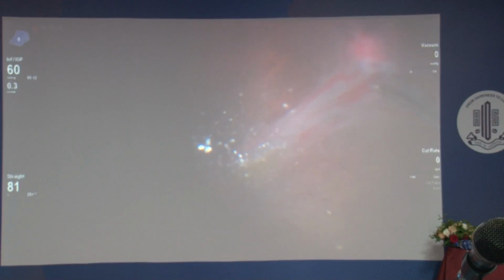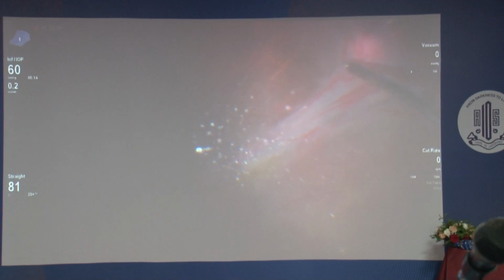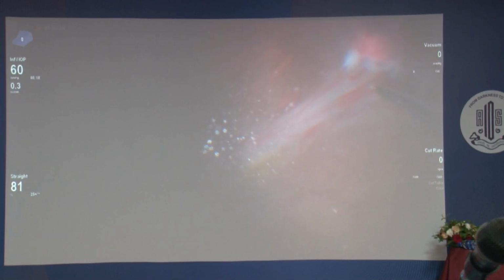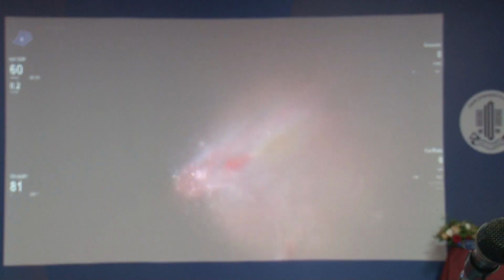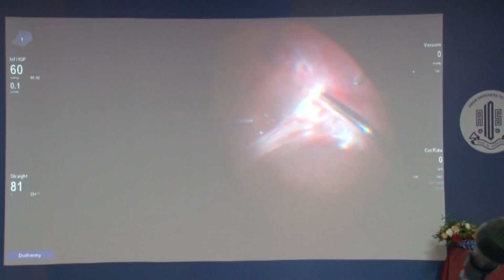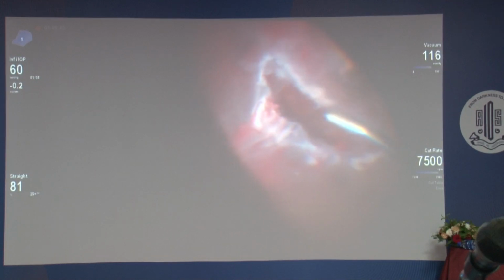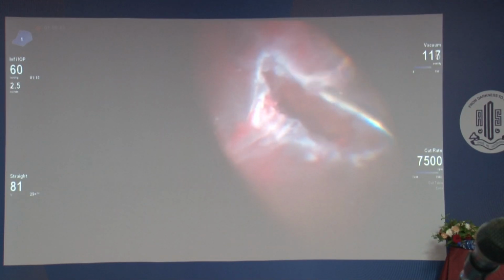We decided to perform inferotemporal retinectomy. Prior to retinectomy, perfluorocarbon liquid was injected to prevent the possible accumulation of submacular hemorrhage. Endodiathermy was used to mark the area of dissection. Retinectomy was carefully performed. The large orange angioma can be seen inferotemporally.